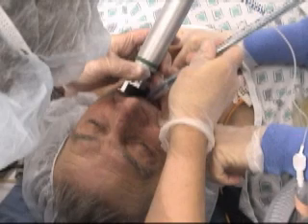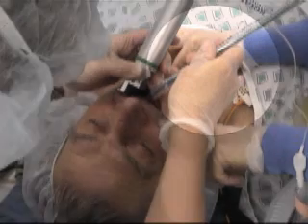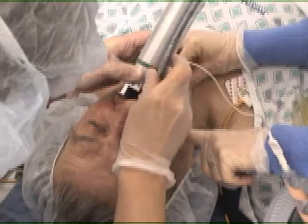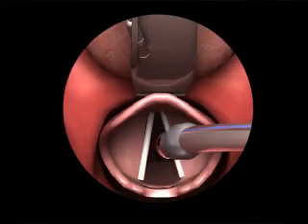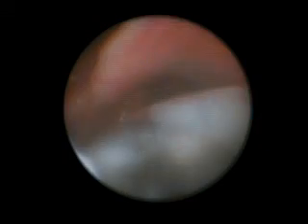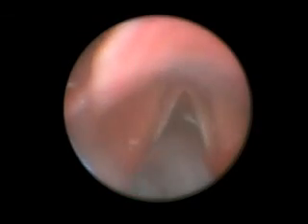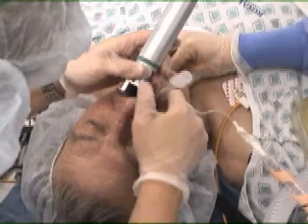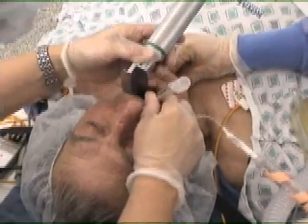Hold the endotracheal tube in your right hand. While maintaining your view of the vocal cords, insert the endotracheal tube into the right side of the patient's mouth. The tube should not obstruct your view of the vocal cords during this critical part of the procedure. Pass the tube through the vocal cords until the balloon disappears into the trachea. Remove the stylet and advance the tube until the balloon is 3 to 4 centimeters beyond the vocal cords.